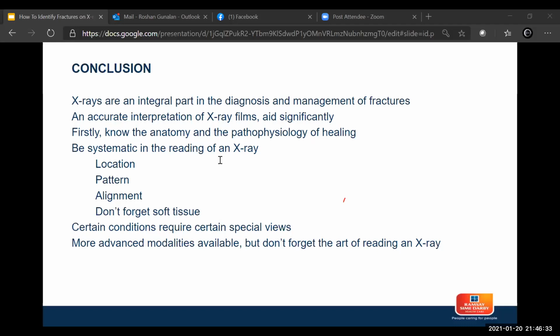All right. If it doesn't unite in a specific time and there is evidence that the healing has stopped, based on the fact that the X-rays look exactly the same, then it's considered a non-union. Okay. So the difference mainly between delayed union and non-union is if a patient has a delayed union, you can actually wait. It's just that the healing is slower.